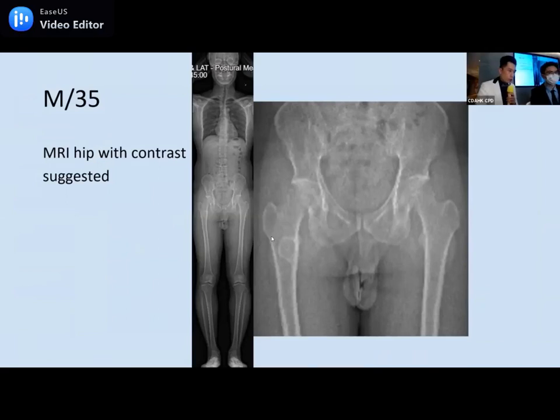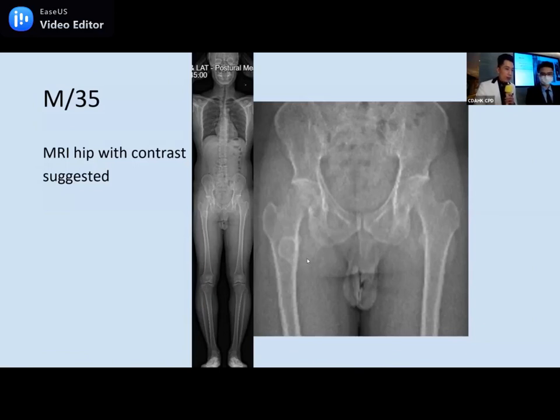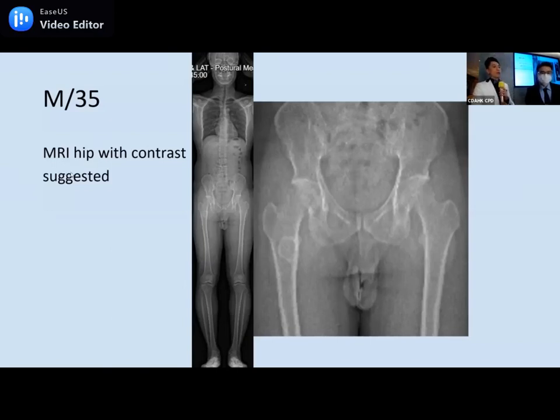This 35-year-old young man presented with back pain and was referred for EOS X-ray examination. Incidentally, we found an opacity — a lesion — in the right proximal femur that is spotted by a thin rim of sclerosis. It looks pretty benign on X-ray: there's no cortical disruption and no soft tissue penetration. It's probably a benign finding, so MRI with contrast is suggested for further evaluation.